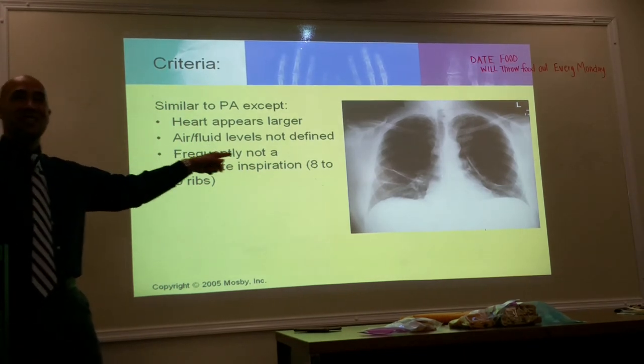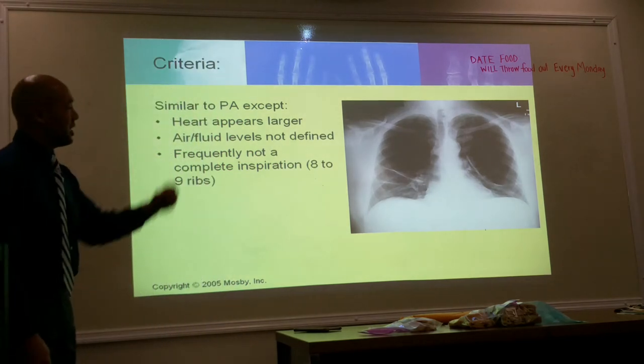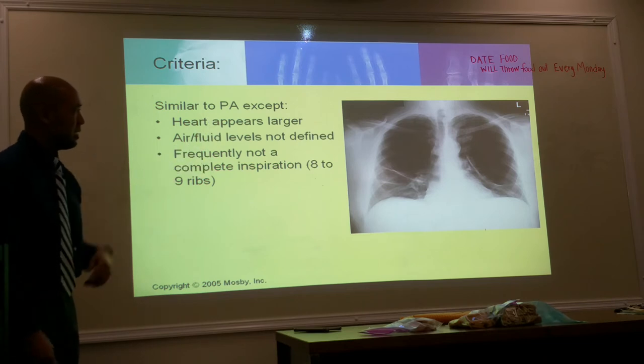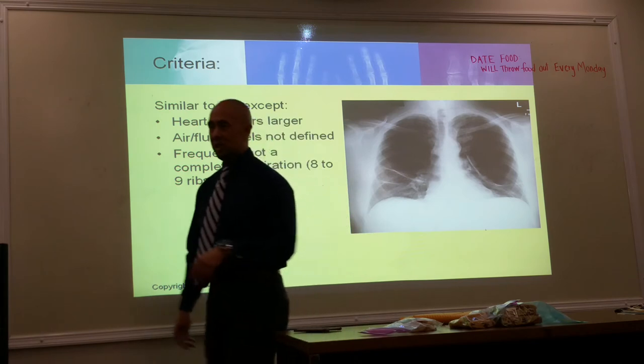Is there any rotation? No. It's equidistant, right? Yeah. How about penetration? Can we see behind the heart? Can we see the T-spine? And can we see behind the heart shadow? Not really. Okay, not really. So this could have been shot a little bit better.